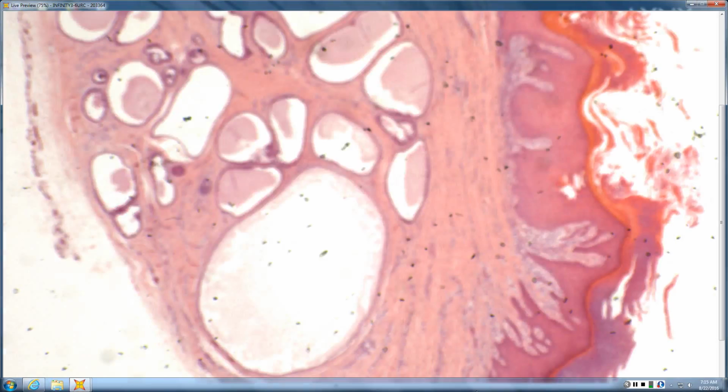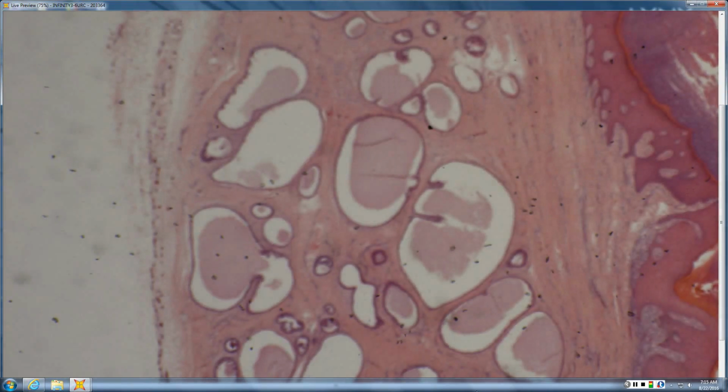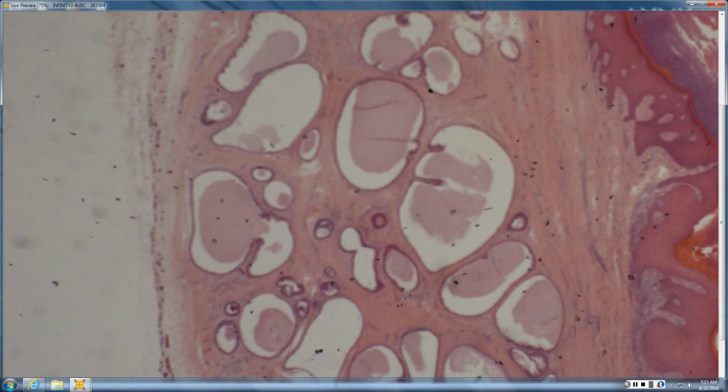Okay, so this one, the last controversial entity, is tubular apocrine adenoma versus papillary eccrine adenoma. I won't belabor this because we're running out of time, but papillary eccrine adenoma has eccrine in the name, so it really should be eccrine, right? Versus tubular apocrine adenoma, which really should be apocrine, whereas in fact both are maybe apocrine. It's hard to say. Now things are kind of changing a little bit. It's more the pattern that you see. There are some clinical differences.